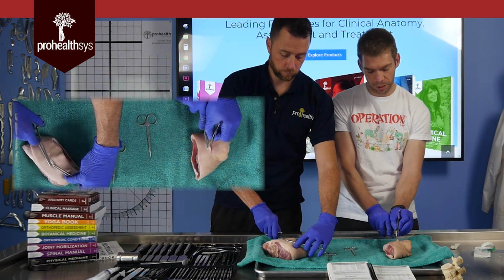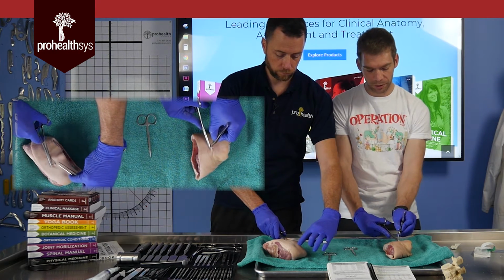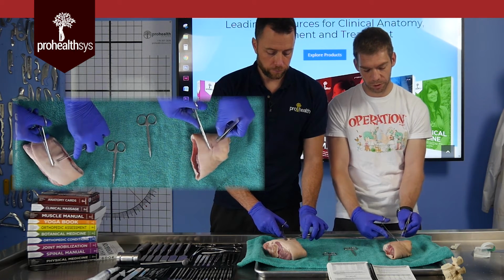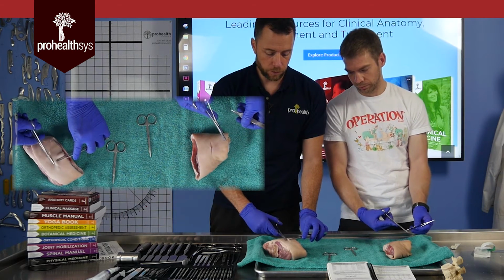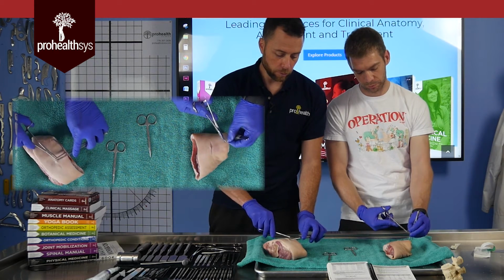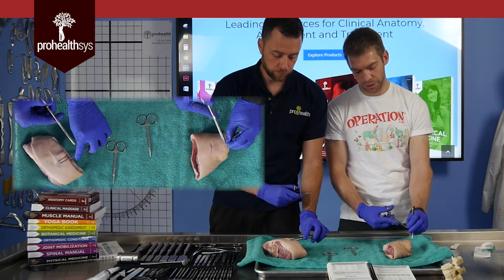What I'm going to do is I'm going to use the natural movement of my wrist to do a circular motion through that skin. Now what I like to do is I like to stop and reload. Dr. Vizniak's not going to reload. It's actually faster for him not to reload. Yeah, if you're trying to cycle through these quickly, I like to go ahead and spin. A little bit of difficulty there, but spin and get yourself right around. So I'll typically hold down with the end of the other side, lift up here, find my opposite edge, and then come on through. And what he did there was quick.